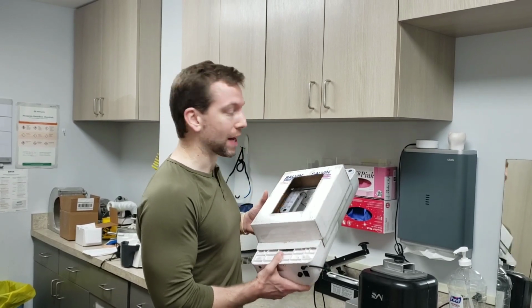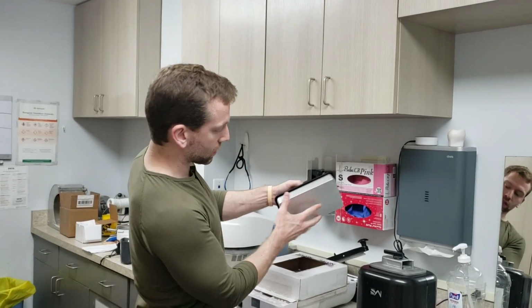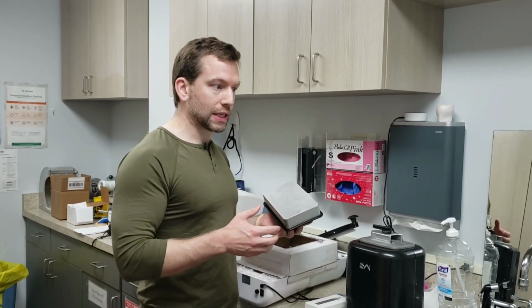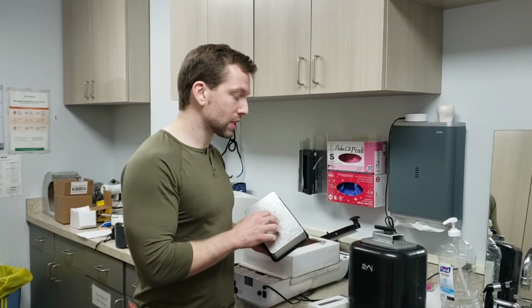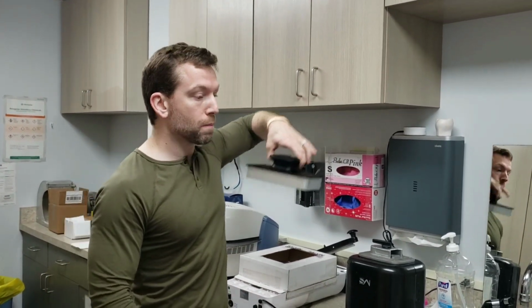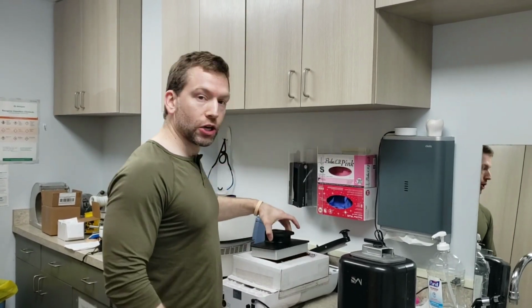Where you got your box doesn't matter. I wanted it to be tall enough so that things could hang off of this, you know, this far, and still not touch the bottom. And people have asked before, why do I like to cure things on here? Well, I like to wash them suspended in my wash units, and then that way I don't have to mess with them. I can literally take this out of the printer, set it in my wash unit, get it washing, take it off, wipe it off, and set it in the cure unit.